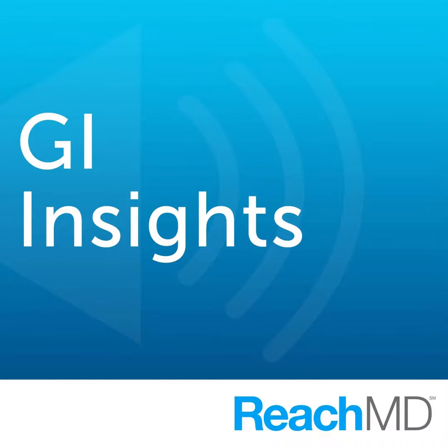So that's a discussion you want to have with the patient: should we do the surgery when your inflammation is under control, or should we keep trying balloon dilation for the rest of your life? I think those are the kind of discussions you sometimes have to have with patients. A fistula by the stricture, for me, is a contraindication. Those patients are better served with surgery upfront versus us trying a balloon dilation and making things worse. So these are some of the indications where from the outset I know that endotherapy will not be of benefit to these patients, and that's a discussion you sometimes have to have with them.